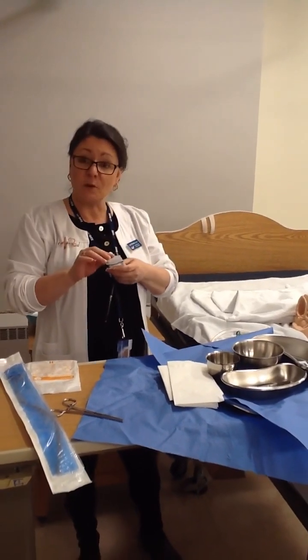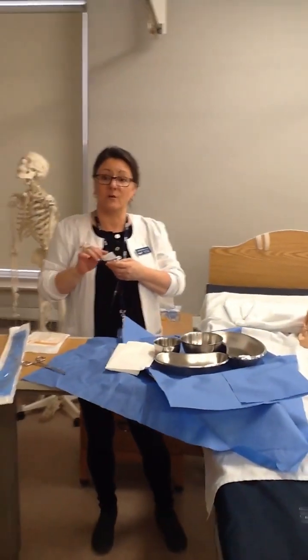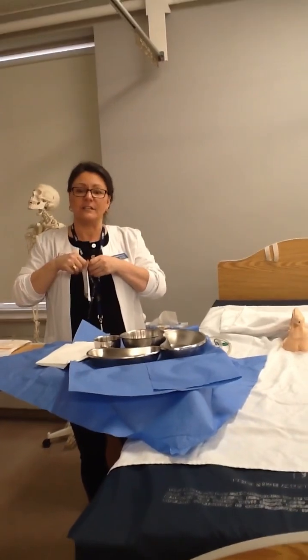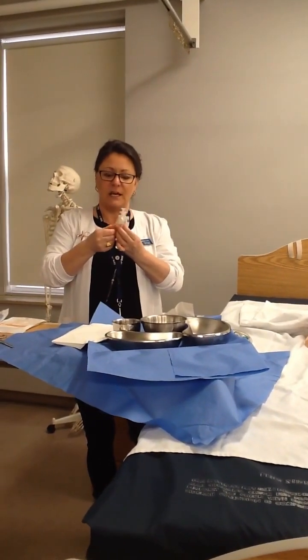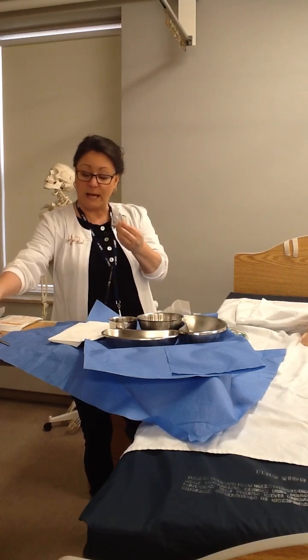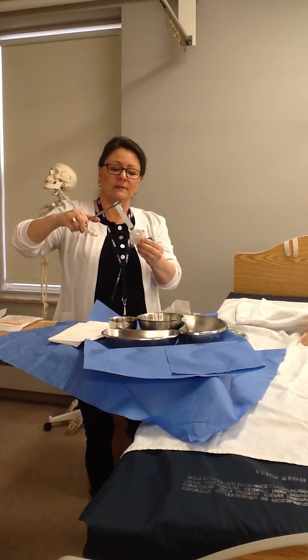In the disposable catheter trays, the 10 mil syringe is already in there with your 10 mils of sterile water, and all you need to do is connect it to your catheter, but there are different types of catheter trays. I'm going to show you the easiest way to hang on to this slippery little syringe, and that's by peeling down the edges like I've shown you in other demonstrations. Pick up your tool, get a nice strong hold on that syringe, take it out of the package.